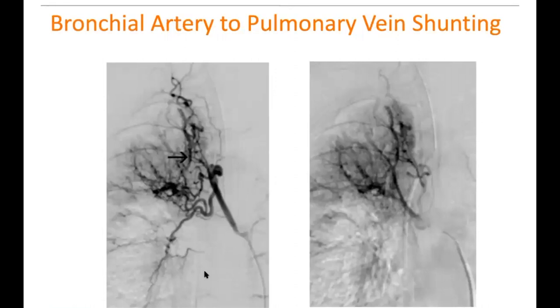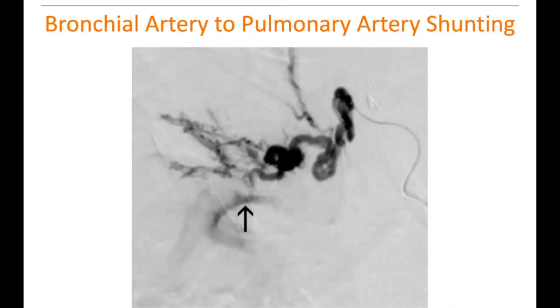If there's shunting, this is what bronchial artery to pulmonary vein shunting looks like. We have the bronchial artery in the arterial phase, and then later in the angiogram we see the pulmonary veins filling — a completely different appearance. For bronchial artery to pulmonary artery shunting, we have this irregular bronchial artery and then can see the outline of the pulmonary artery filling with contrast in a smooth, round course — a very different appearance from the irregular vessel feeding it.